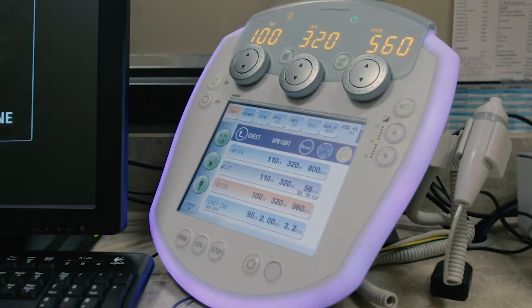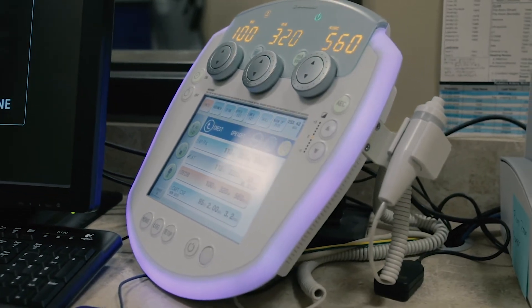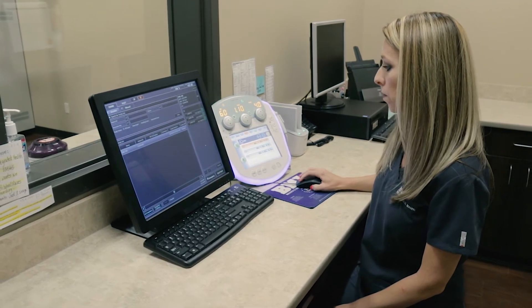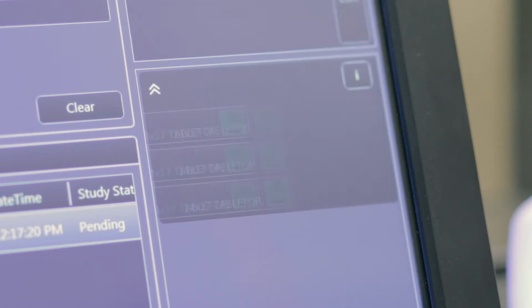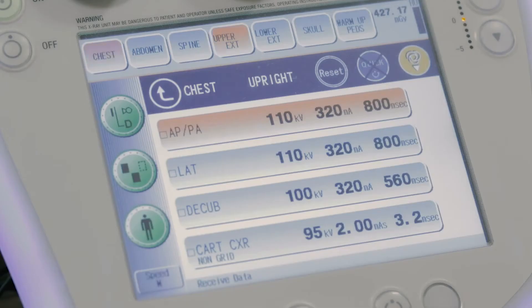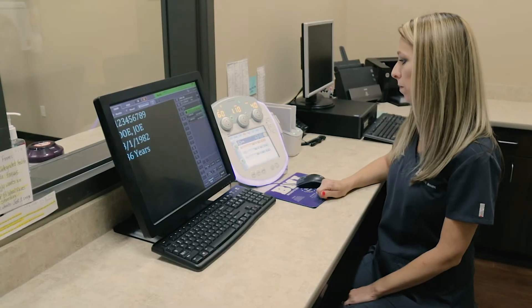This very user-friendly system allows technologists of any experience level the ability to jump in and easily manipulate the equipment. With the ability to integrate with your DR platform of choice, the technologist can select the study from the workstation and the system will automatically set the appropriate technique on the generator based on the corresponding APR.